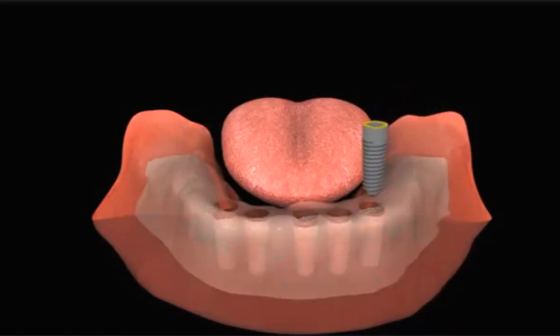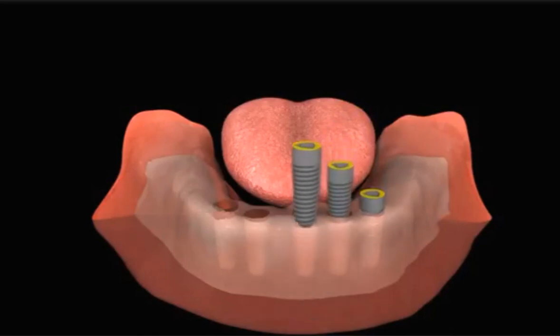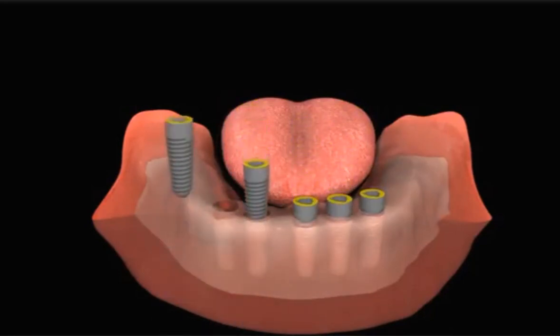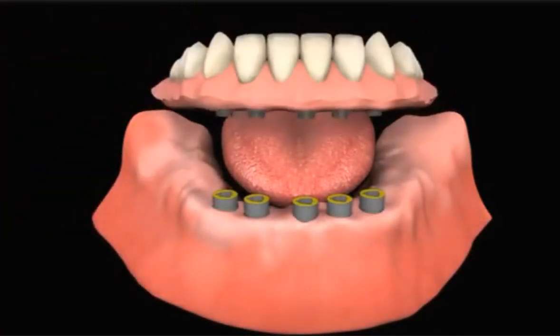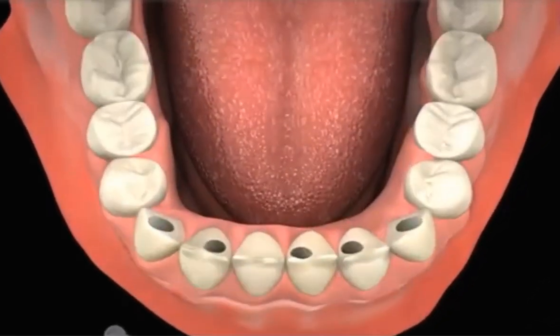With this technique, four to five implants are placed into the jawbone, which are then used to support a denture. The implants provide a support mechanism similar to that of natural teeth. The denture fits over the implants and is fixed to them by the dentist with small screws.